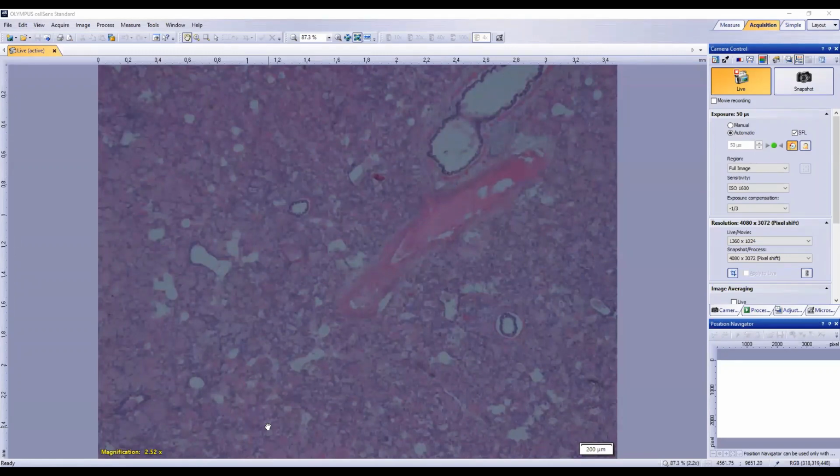Now, of course, specialized epithelium in the lung, the type 1 pneumocytes make themselves as thin and as flat as possible to facilitate gas transfer. But if there's damage, then they just have to patch the defect as best they can. So type 2 pneumocytes, and eventually there's maturation.